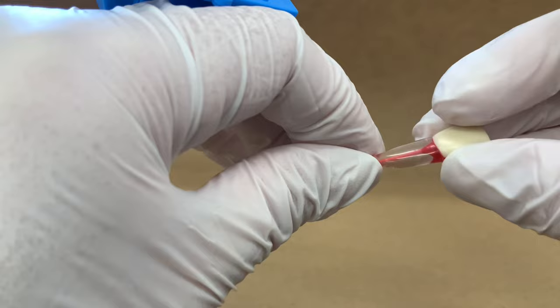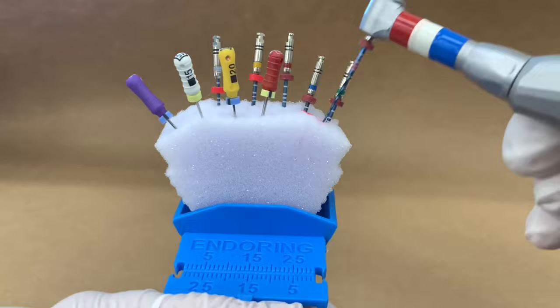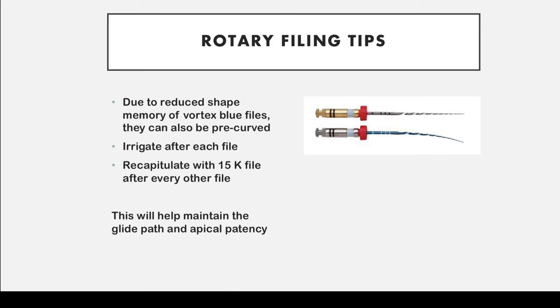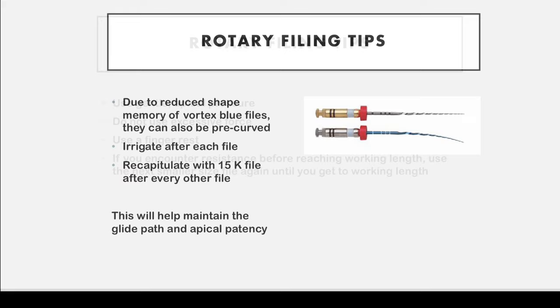On this plastic tooth there is still quite a bit of red wax, so I will need to make a few more passes with a size 40 file and plenty of irrigation.